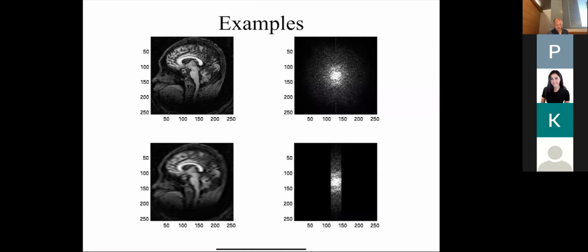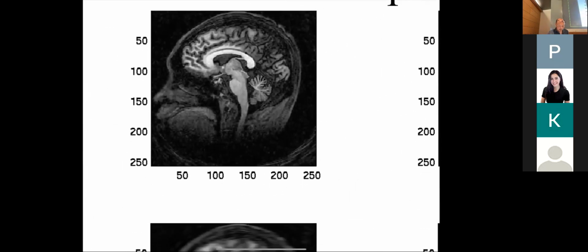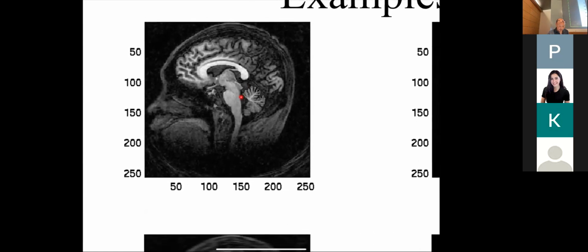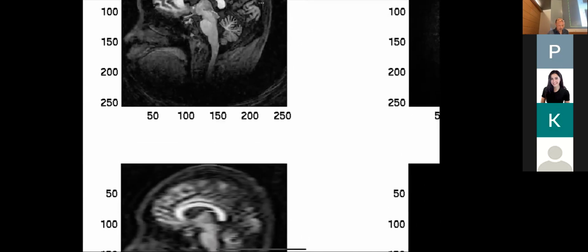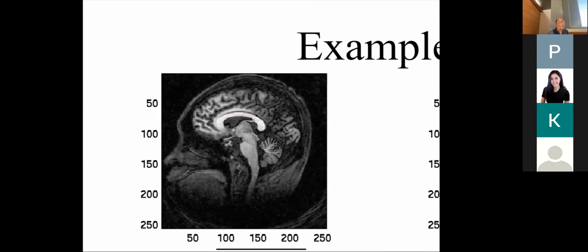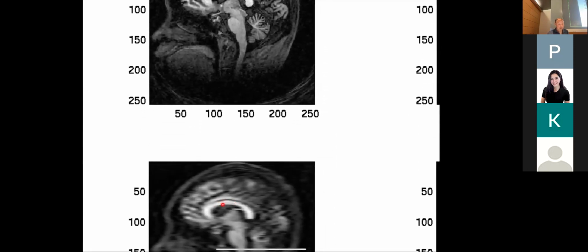So in the last minute, let's look at this example. This is the image. This is its Fourier transform. And here I zeroed out these parts of k space. Remember, the information represented by these components is like these vertical stripes. So let's look at our image and see what happens to the vertical stripes. Here, you're noticing that this edge is pretty sharp. We have a pretty sharp delineation of that edge. If I go here, notice how that edge has got blurred out. Whereas here, if I look at a horizontal edge, it's pretty sharp, and here, it's still relatively sharp, because I've kept the information about these stripes, but I've lost information about those stripes.